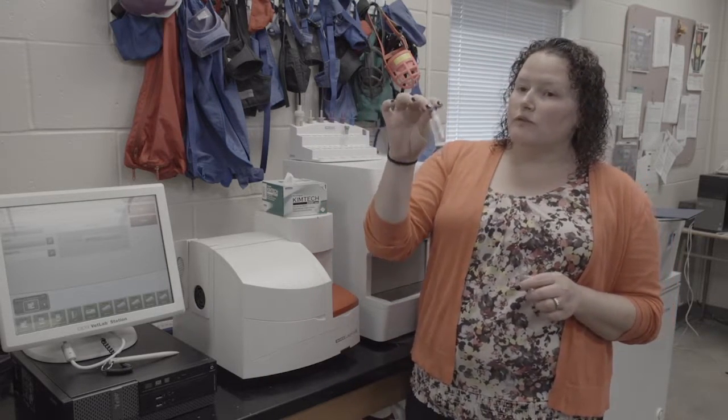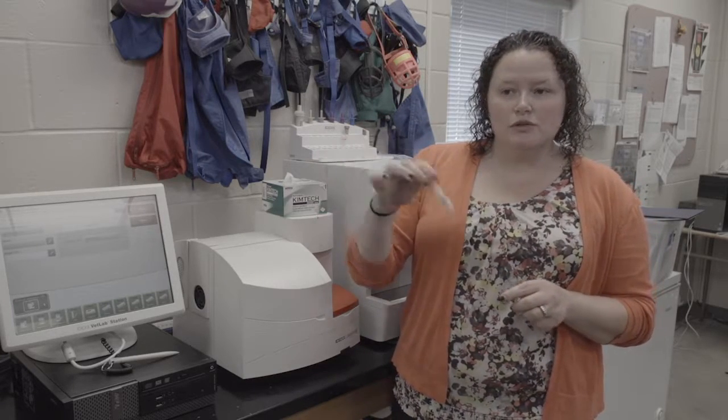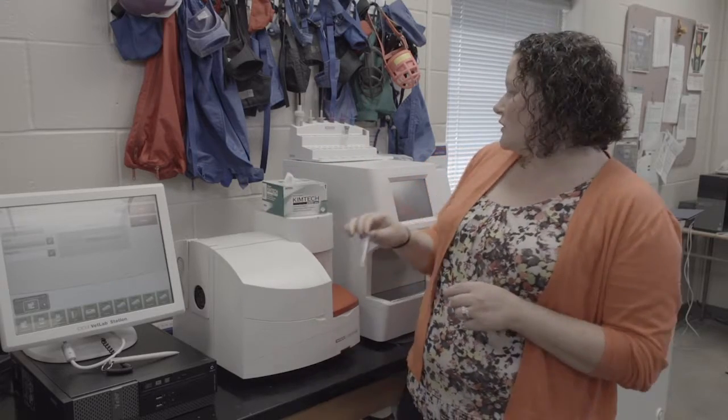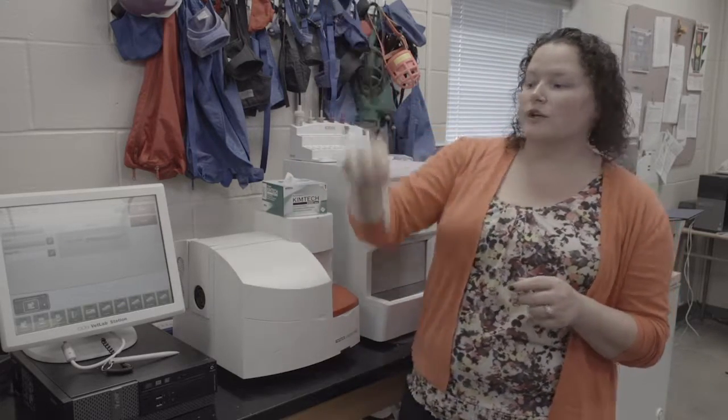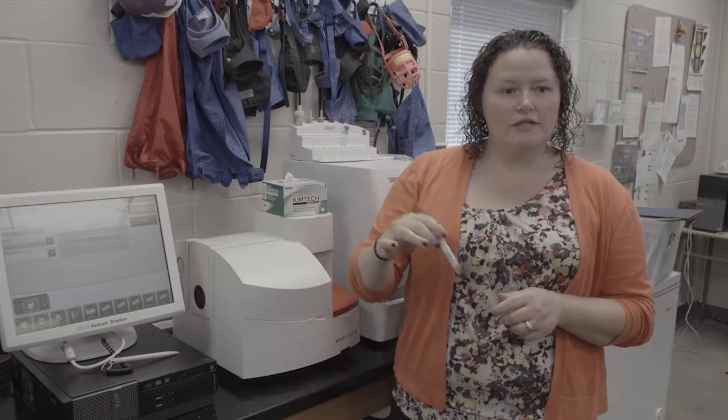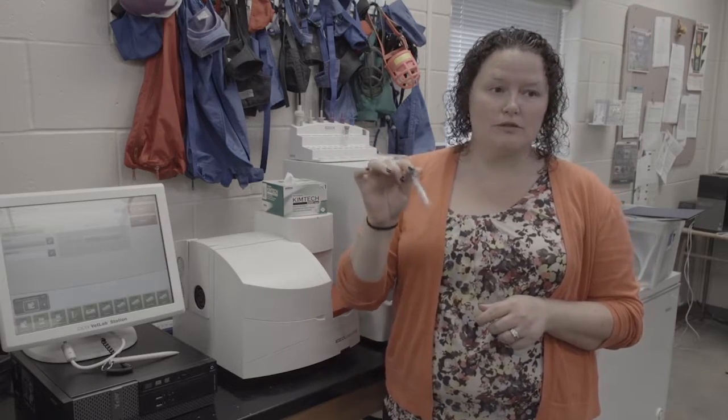So 0.5 to 1.5 mLs in this. You want to make sure when you're filling it, it gets a good 10 inversions right then. And then if you've set it on the counter or set it in the tube holder while you're waiting to run the analyzer, right before you pick it up and put it in the analyzer, it needs another good 10 inversions before it goes in as well. You want to make sure that this is thoroughly mixed to ensure your best results.